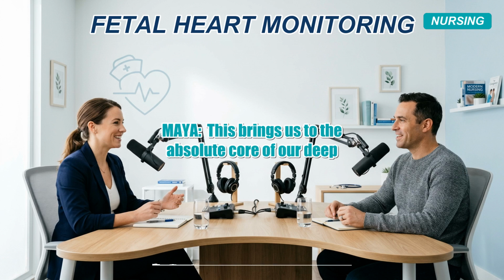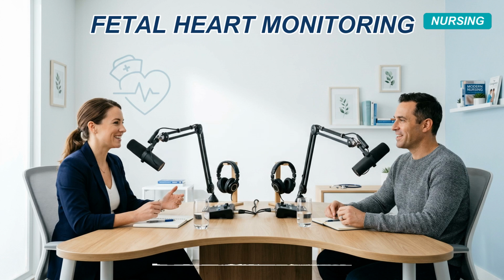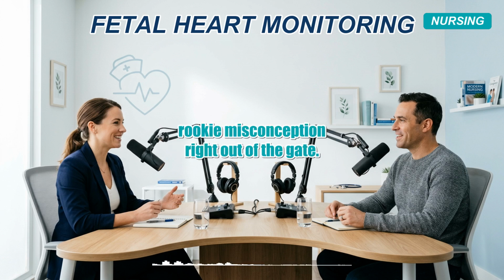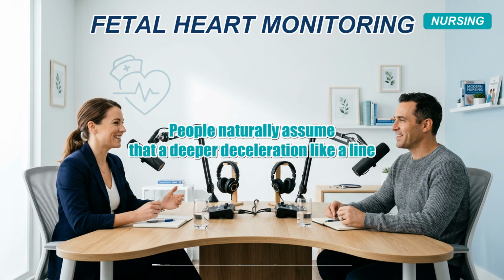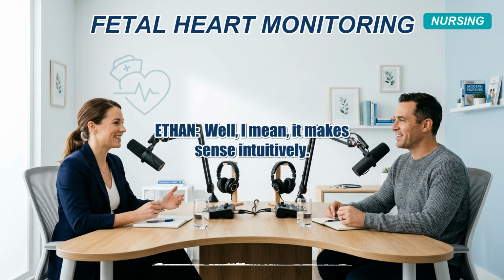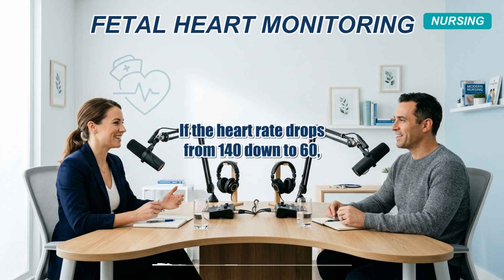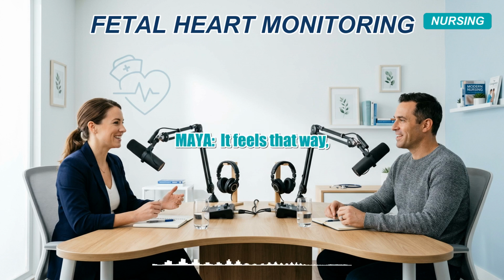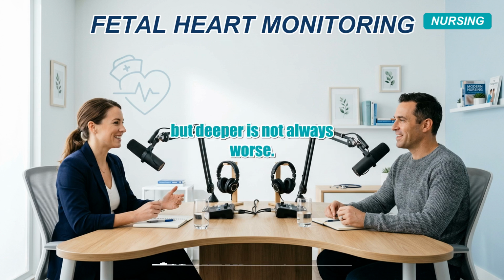This brings us to the absolute core of our deep dive, decoding decelerations. Right, the heart rate drops. And this is where we have to debunk a major rookie misconception right out of the gate. People naturally assume that a deeper deceleration, like a line that drops really low on the graph, is inherently more dangerous. Well, it makes sense intuitively. If the heart rate drops from 140 down to 60, that feels like a bigger emergency than dropping to 120. It feels that way, but deeper is not always worse.